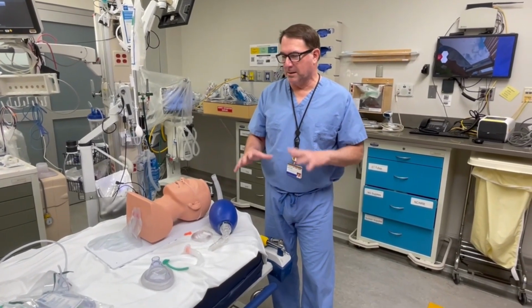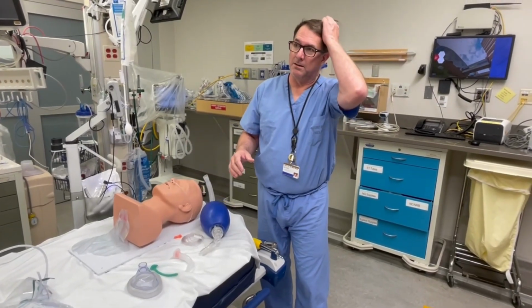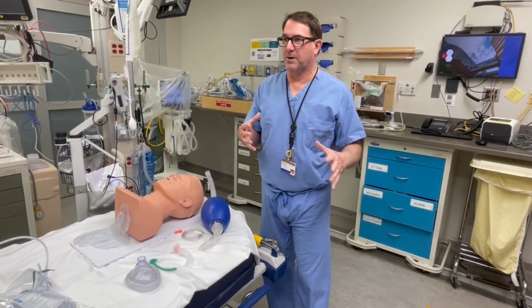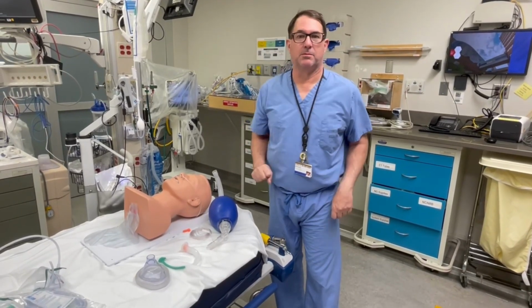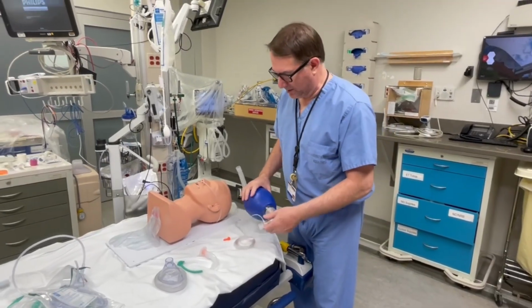I'm going to talk about bag valve mask ventilation, and mainly in the setting of what we'll call the rescue, like an unsuccessful first attempt intubation, and we're going to bag the patient up.